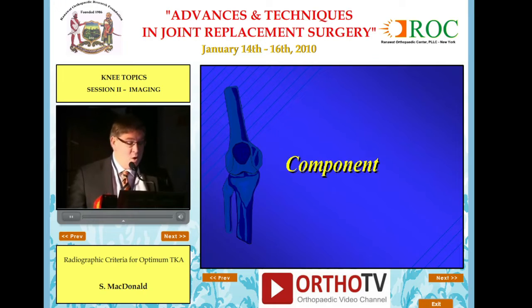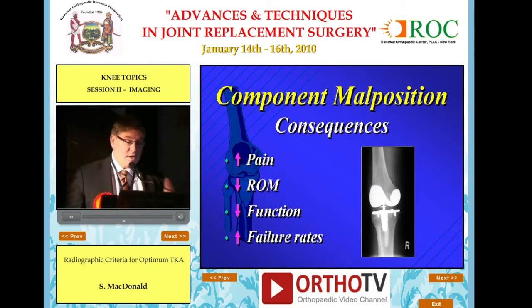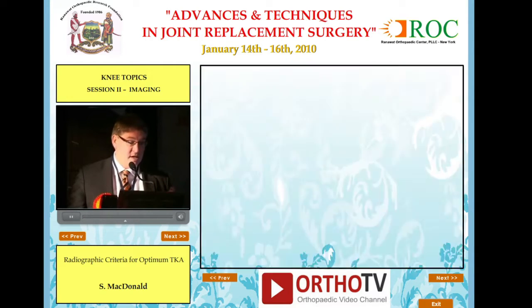With respect to the components themselves, we know that component malposition has a lot of consequences with increased pain, potential for range of motion, functional issues, and potential for failure rates.